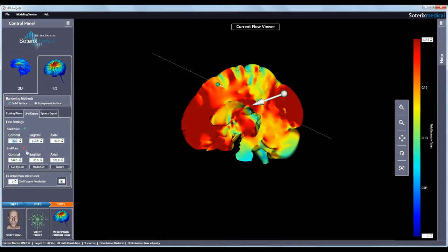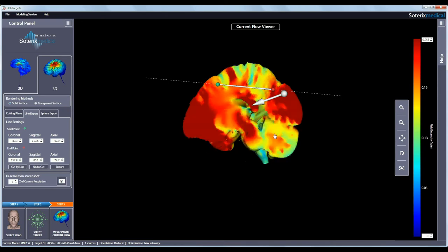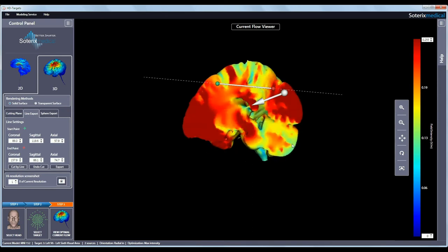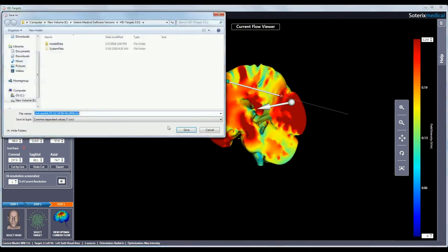Likewise, click on the red crosshair to set the end point. Hit cut by line to visualize the cut brain volume at the level of the line. Hit export to save the induced values in a CSV file for further post processing.